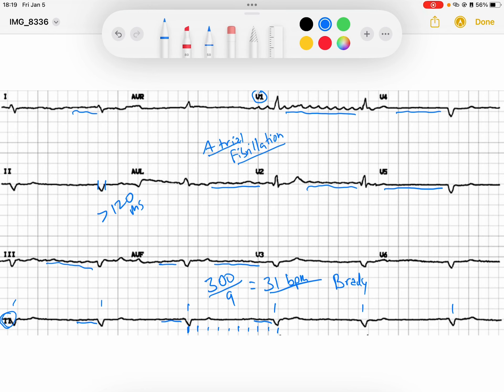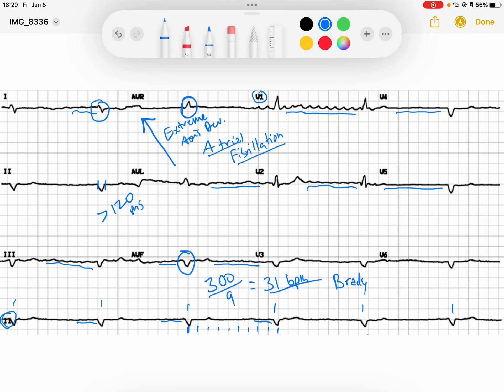And that QRS axis — it is positive in AVR, it is negative in lead 1, and it is negative in AVF. So what does this tell me? That means my QRS axis is going up and to the right. So that is extreme axis deviation. And that extreme axis deviation is telling me that perhaps this wide complex QRS that we're seeing is a ventricular escape rhythm.